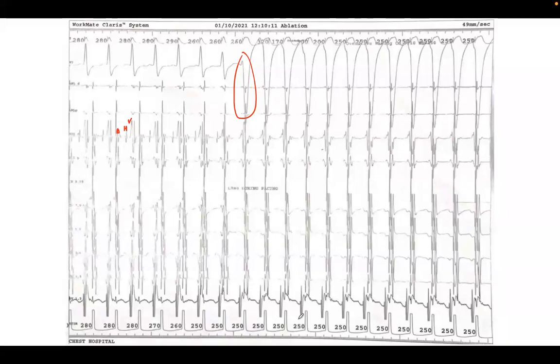Makes sense, Juan? I also just wanted to make sure of something. First we were pacing the atrium, so the ventricle was staying the same. But then at this point, the ventricle QRS changed. It means that I believe something took over on the ventricle side.